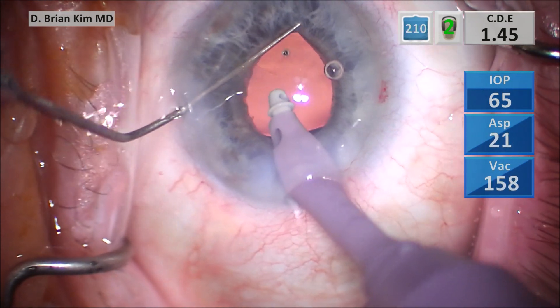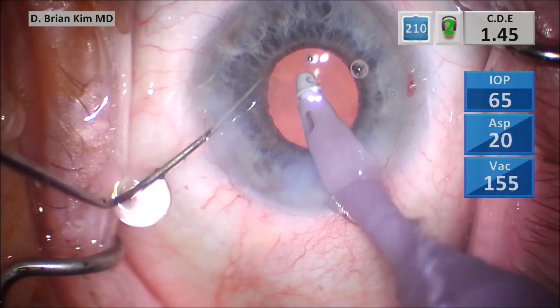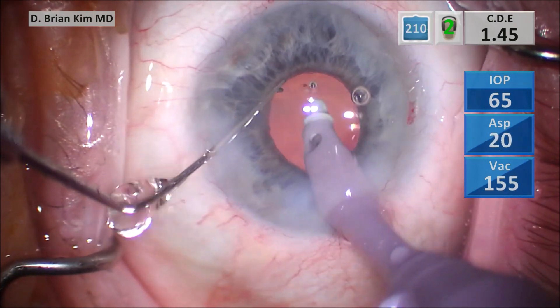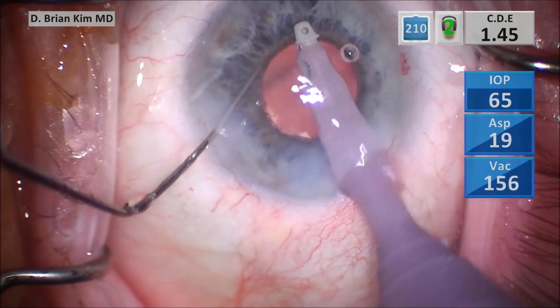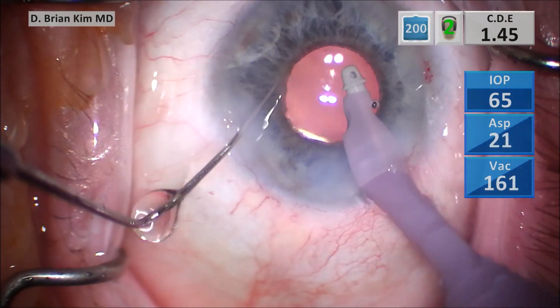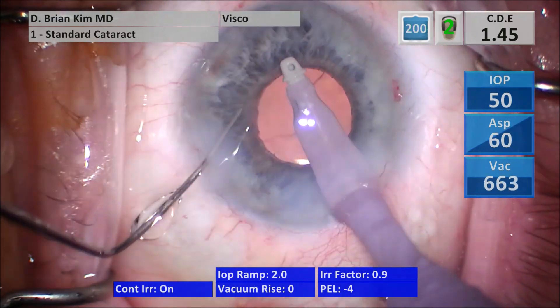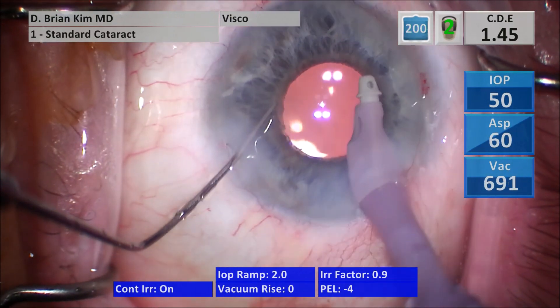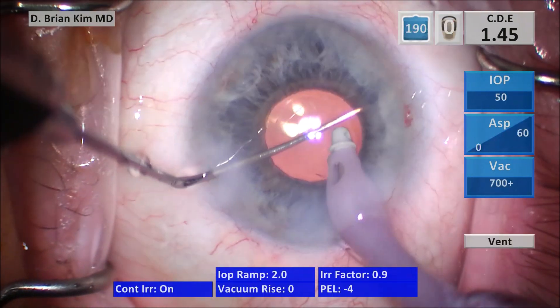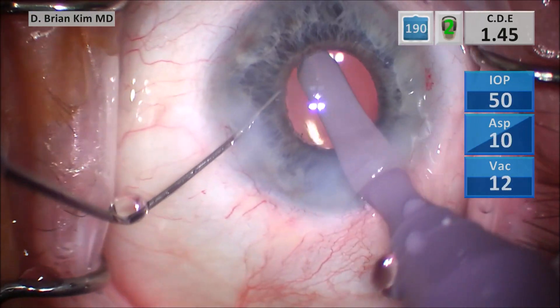I remove all the viscoelastic from within the bag, tapping the lens, making sure there's no viscoelastic. I'm gently going around circumferentially, then switching to visco mode, removing all the viscoelastic from the anterior chamber. I like to hold the Maltzman in place in case the IA tries to snag the iris — I have the Maltzman there to help control the pupil.